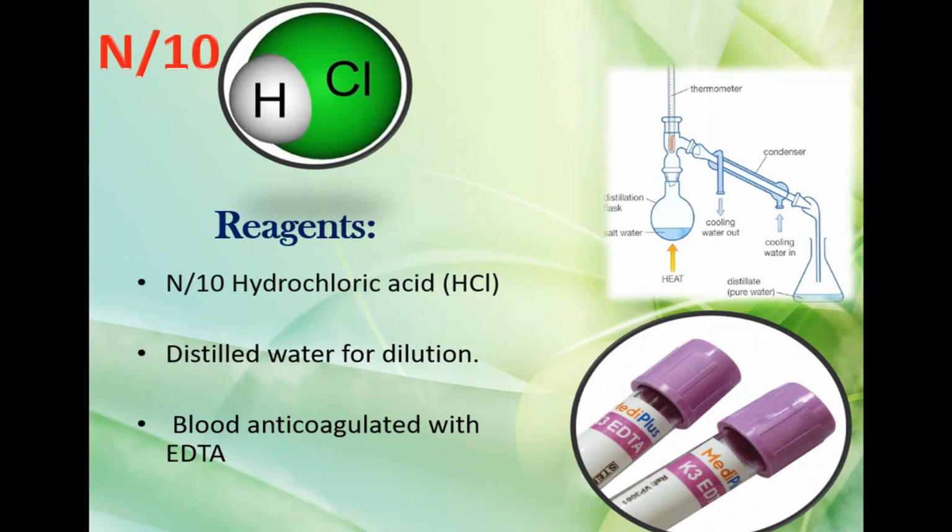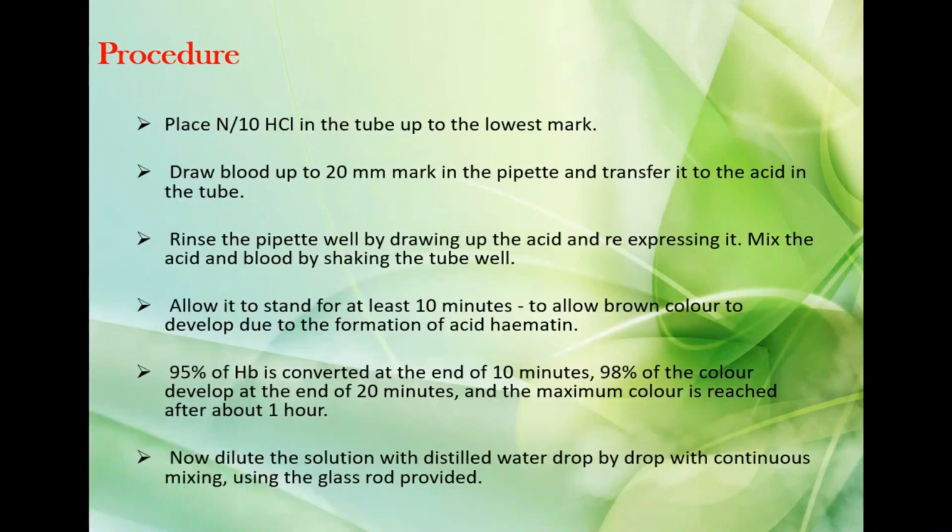Whereas in clinical laboratories, they collect the sample and add EDTA, which is an anticoagulant, so that the blood will not coagulate or clot. So an anticoagulant will be added to it.